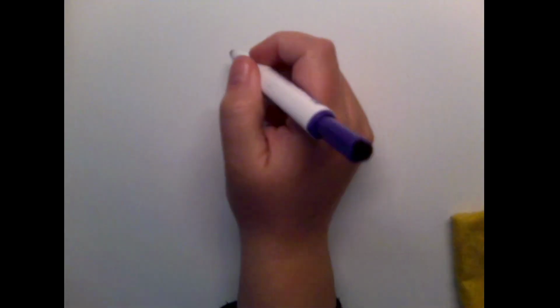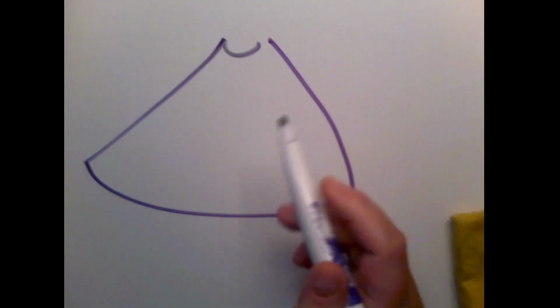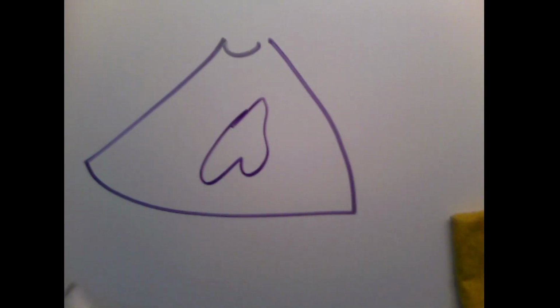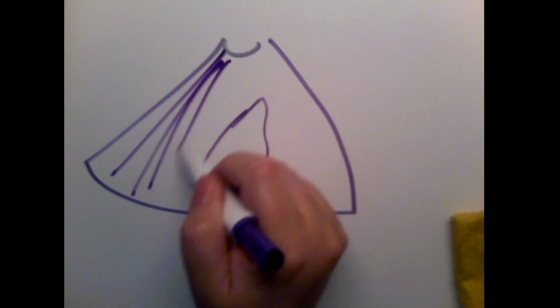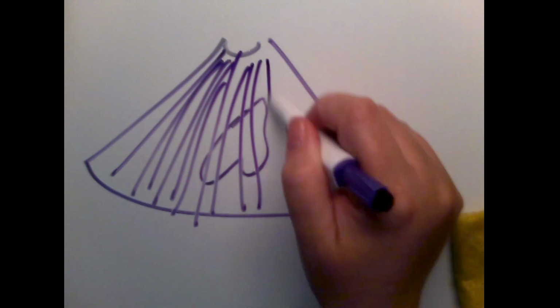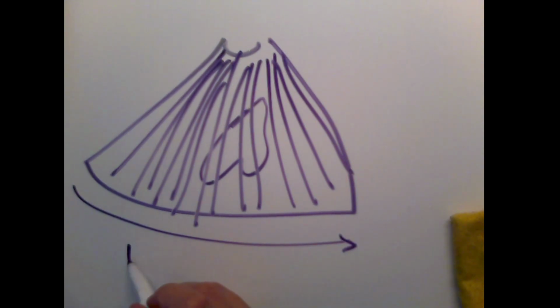So if we think about our picture, when we've got a really, really wide picture like this, say the structure that we wanted was here, we're going to spend all this time making pulse lines out here, then we're going to get into the area that we want, and then we're going to spend a bunch more time getting the pulse lines out there. So a wider sector is going to take longer, it's going to have a longer T-frame, meaning lower frame rate.